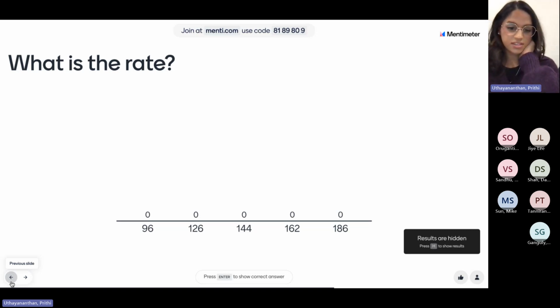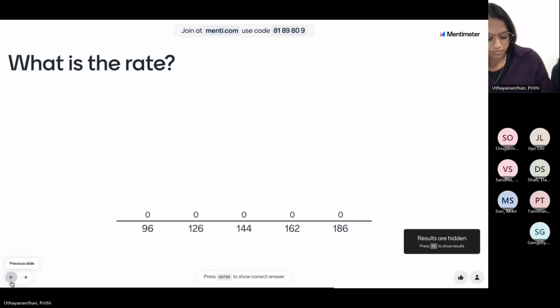So moving on to the ECG that the patient would have got. Yeah. So your ECG's come back, and you've done all the patient details, and it was taken about 10 minutes ago. The first thing you want to look at is the rate.